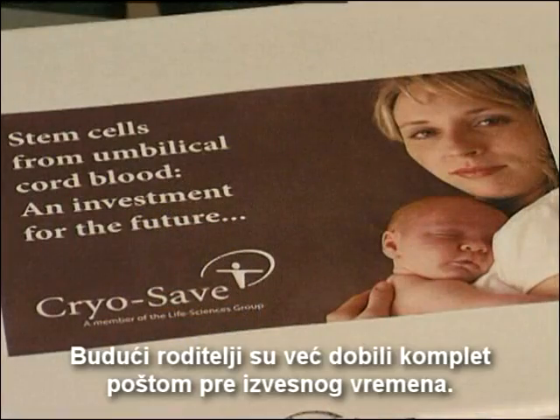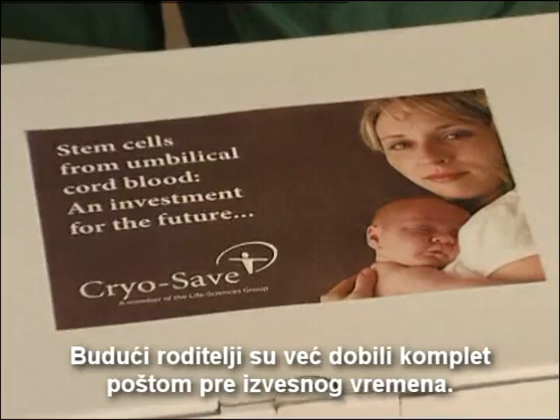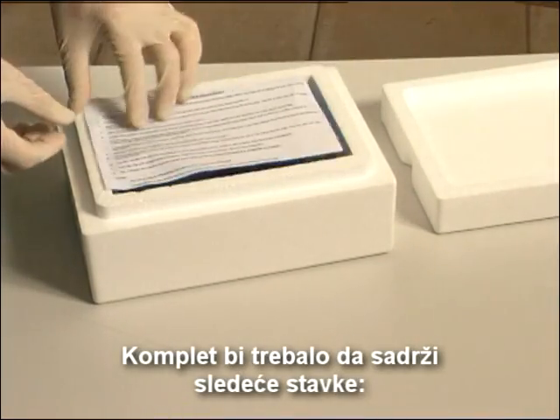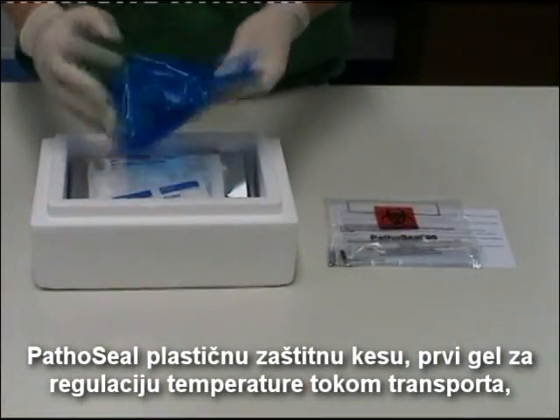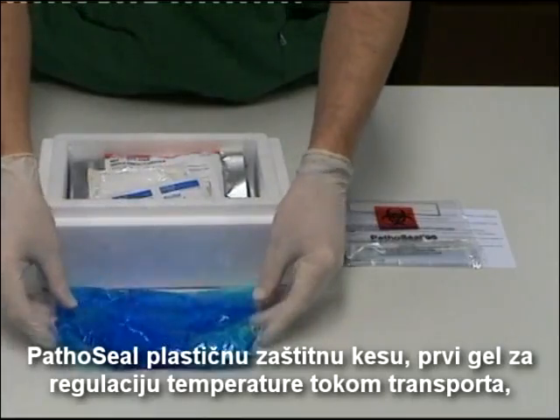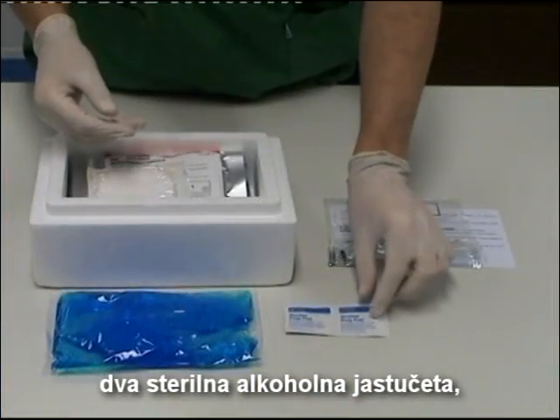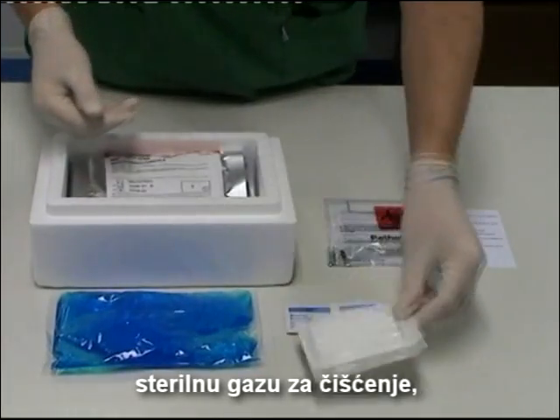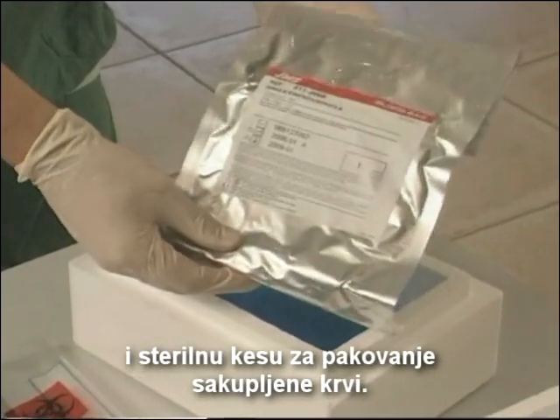The parents-to-be already received the collection kit in the post some time ago. The isolation box should contain the following items: the PathoSeal plastic safety bag, the first gel pack for temperature control during transport, two sterile alcohol pads, sterile gauze swabs, and the sterile packed blood collection bag.